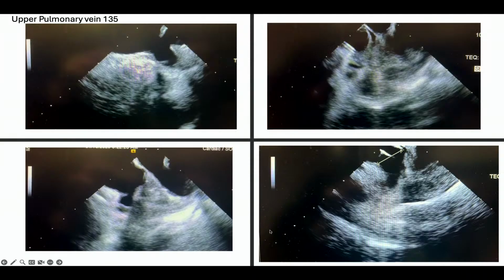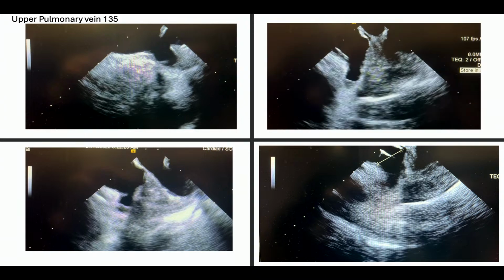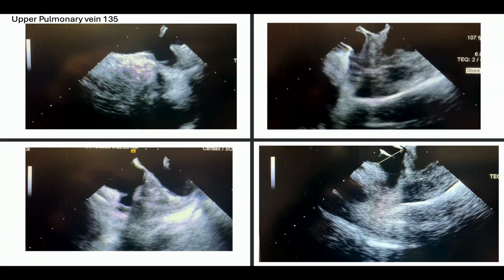This is more ideal for the body and where you're going to land with the Watchman device, okay? We can do our measurements and confirm the TE measurement from prior or the CT measurement prior, we double check, okay? And we can also measure the LA pressure because it's important. When you're hypovolemic, your appendage may look smaller, so it's important to know that.